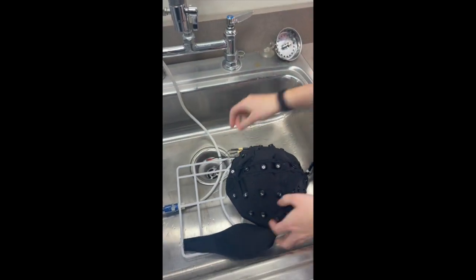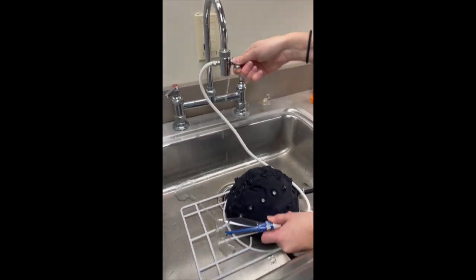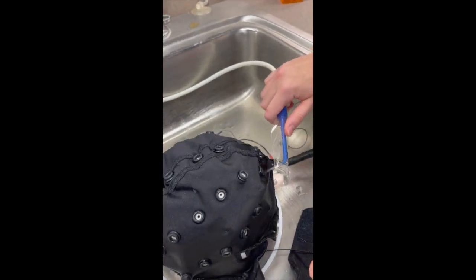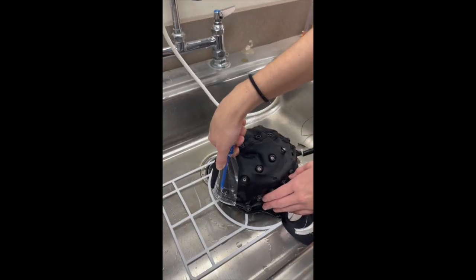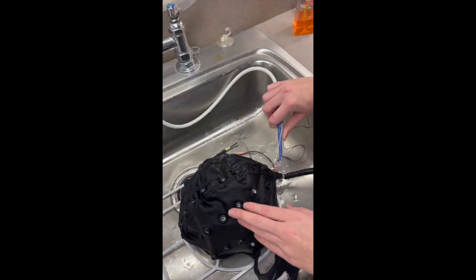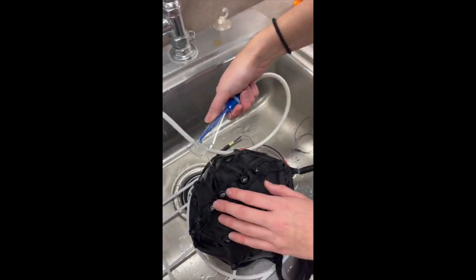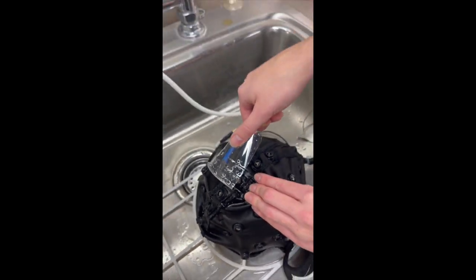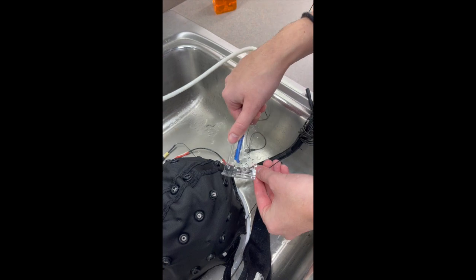Place the cap into the sink for washing. Turn on the water jet by moving the lever up and adjust the pressure to provide a strong jet of water. The water jet has a splash guard on it to prevent splash back. Go row by row with the water jet to remove gel clumps from the bottom of the electrodes — going row by row makes it easier to keep track of which electrodes you've already cleaned.